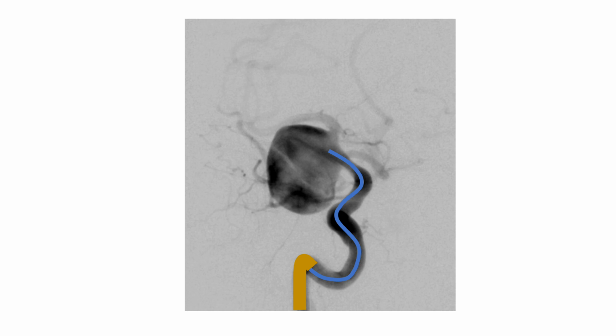So you take your distal access catheter, like a Neuron or a Navien or a Cat 5 or a Cat 6 or whatever, down here. Take your microcatheter to the mouth of the aneurysm, push your wire. As you push, the wire will exit out, but with a big loop. Now, obviously, you cannot have the loop because here you're going to put a flow diverter, and the flow diverter has to be across the neck, not looped. Let me show you a very simple technique which was shown to me by Dr. Dodi. Before that, we used a much more complicated technique.